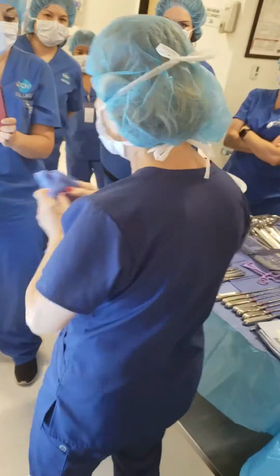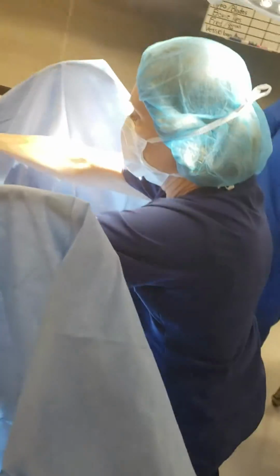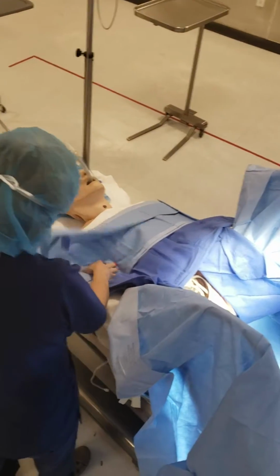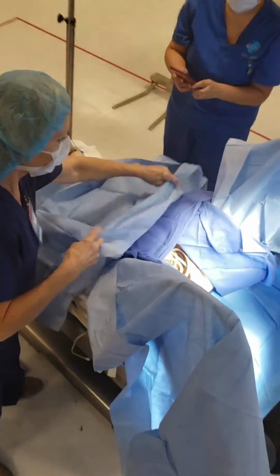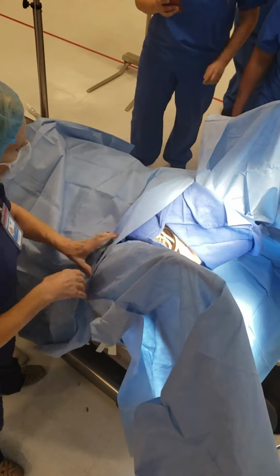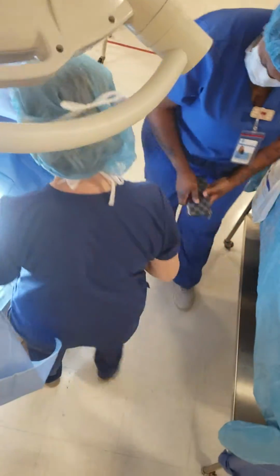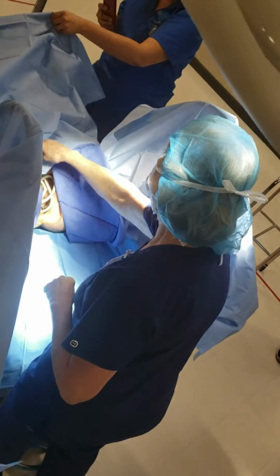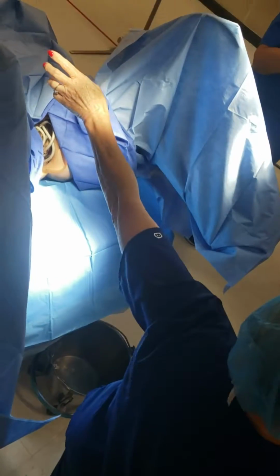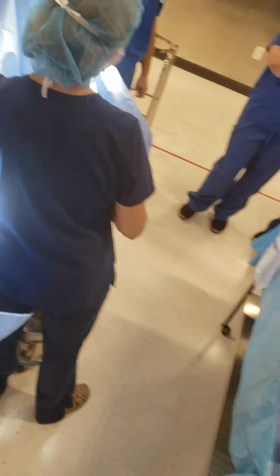Then I'm gonna put one up here, put one up here, and then my other drape goes across this way. This goes up, this goes this way. Is it just three of the towels that you use? Doesn't it go up for patients to breathe? Yes, it does. Now, suction, if we decide to have suction, there should have been suction tubing in here, but there isn't. The suction tubing will be thrown off and plugged in, because if she wants to suction, then it's ready to go right there.